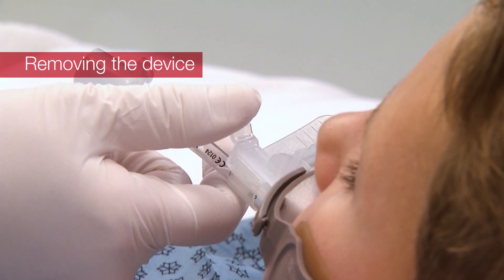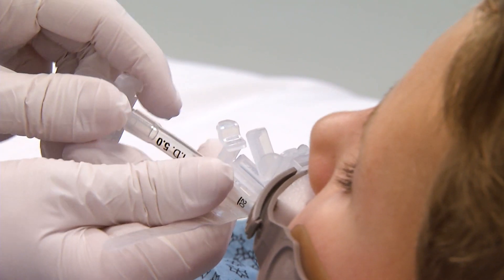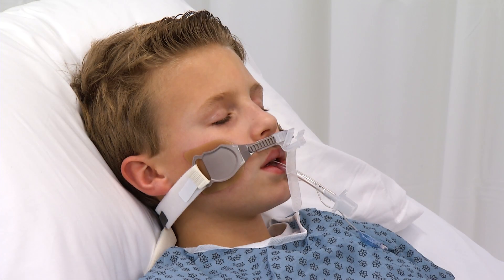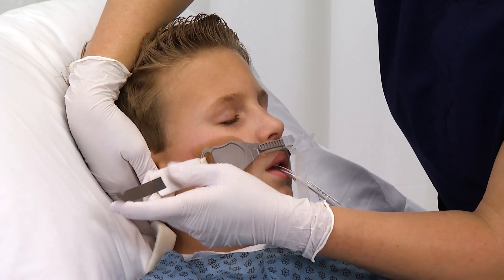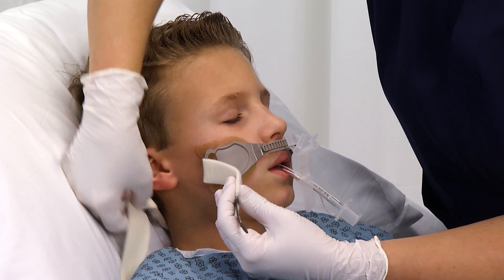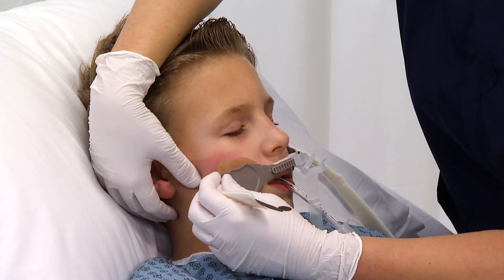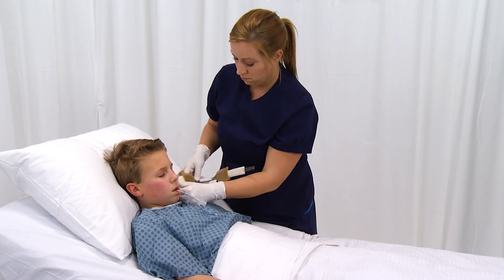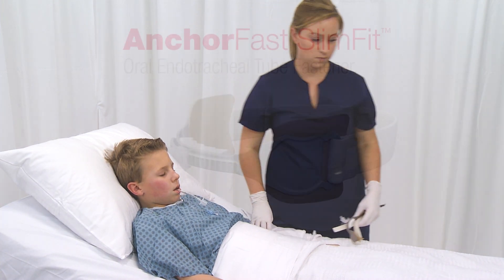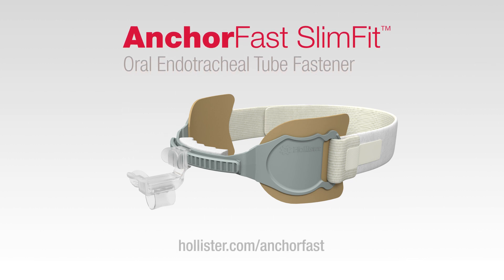Release the security clamp holding the wrap in place. Carefully remove the wrap from around the ET tube. Release the neck strap by unfastening the hook and loop closure at the gray tab. Remove the skin barrier pads by gently peeling them away from the patient's skin.